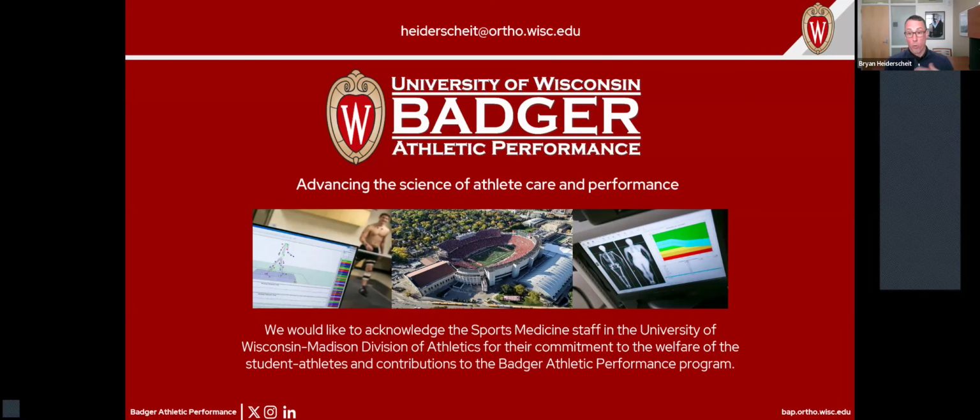Of course, any sort of repeat testing begs the question of, well, how reliable is this? And so we've actually done internal reliability testing both within examiners and between examiners, and we've shown very good consistency. I think the more examiners we bring into using this technique, we certainly need to expand that further and establish it in a more robust way. But I think there is very good consistency within the individuals who are currently part of this ongoing study.